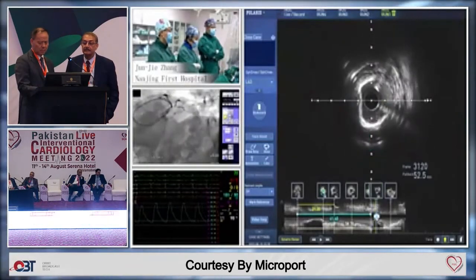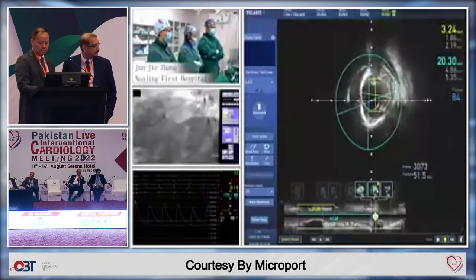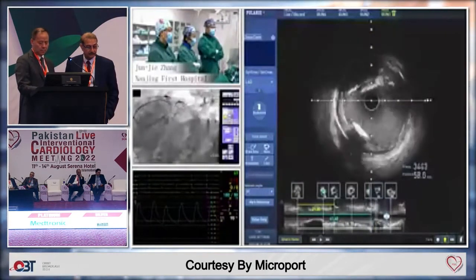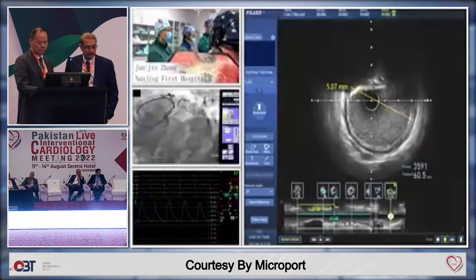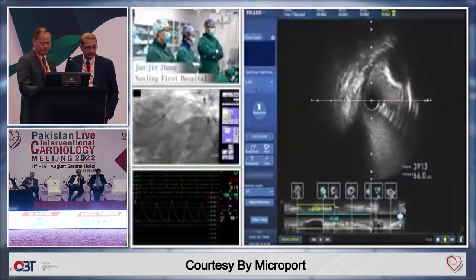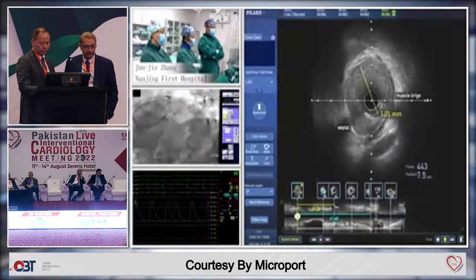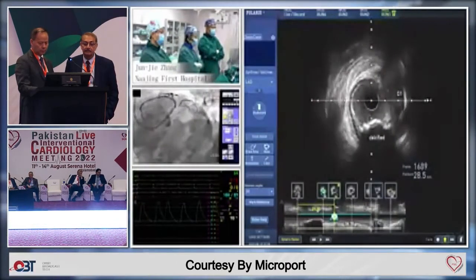And then here, this is the distal left main. The calcified plaque angle is about 220. Then pull back. This is the left main body. And the vessel diameter is about 5.0 millimeters. Then pull back. This is the ostium left main. The whole left main vessel is not normal. We measure the narrowing from the distal reference to diagonal 1 as 21 millimeters.